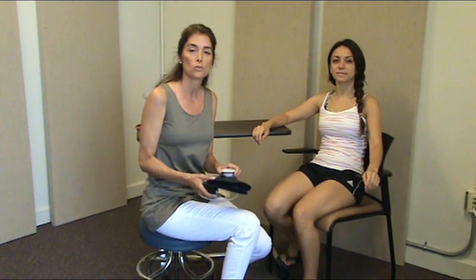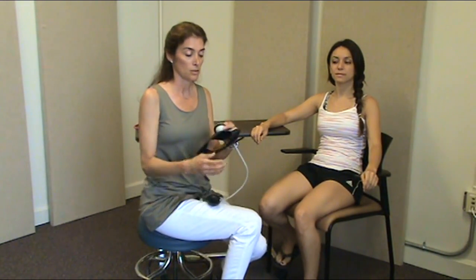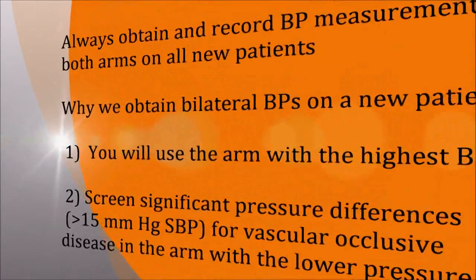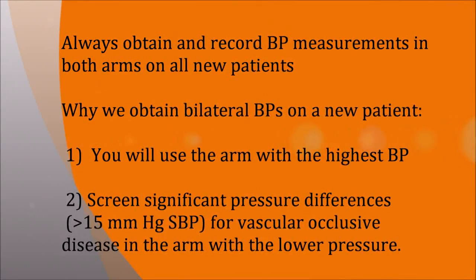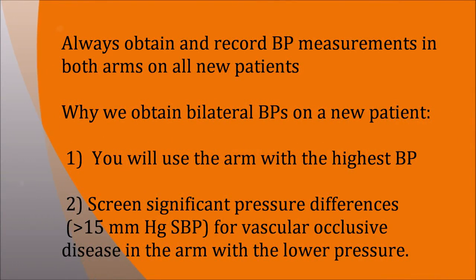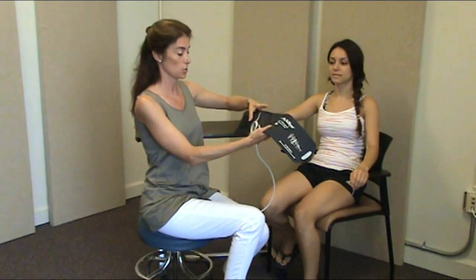This video is going to demonstrate how to do the blood pressure measurement. And there are blood pressure cuffs that can be used on both arms. And it's the same blood pressure cuff, you don't have to change it.